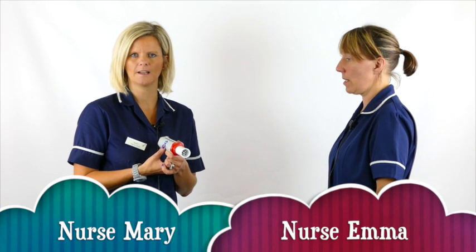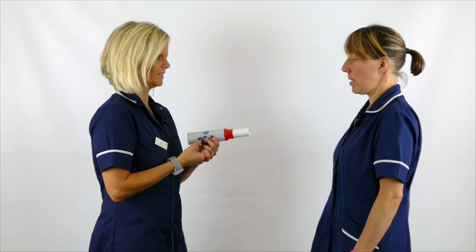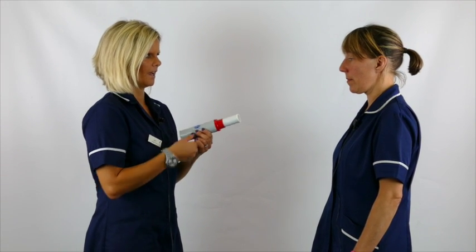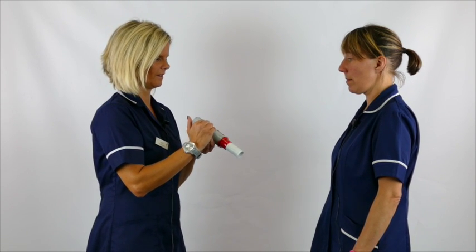This is a peak flow meter and we're going to take a measurement. Okay Emma, so what I need you to do for this test is to take a nice big deep breath in and a nice sharp blow, keeping the meter straight and not touching your fingers on the dial here.